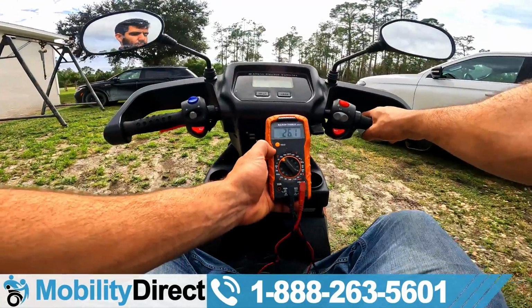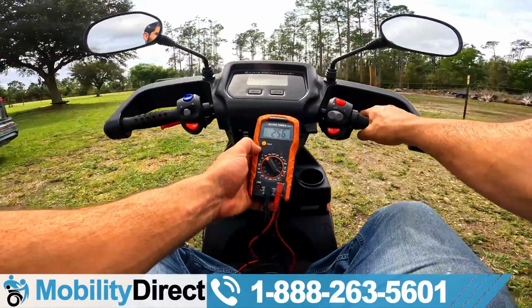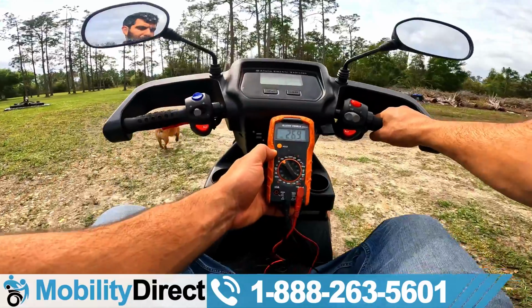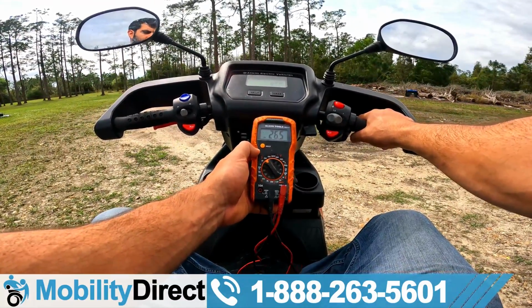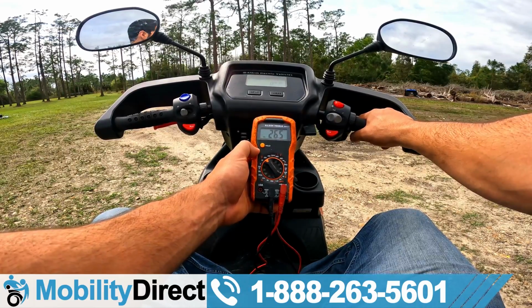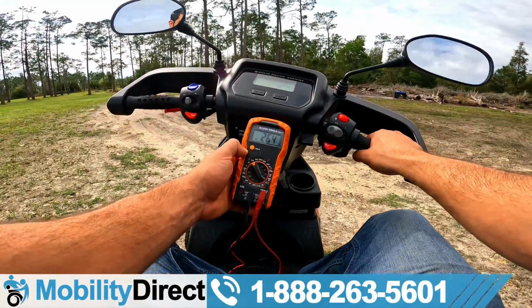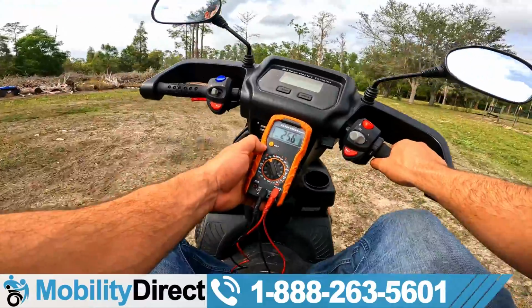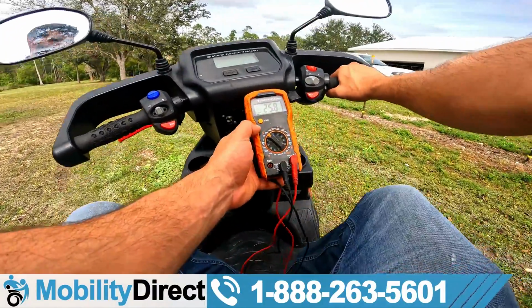26.3, 26.2, 26, 25.8, 25.6. Okay, 25.7. So it's not really losing voltage too much, like how I was explaining. If it goes down below or even close to 24, that would be a sign that your batteries are not able to hold voltage under extreme load.